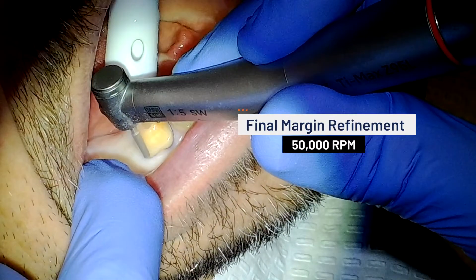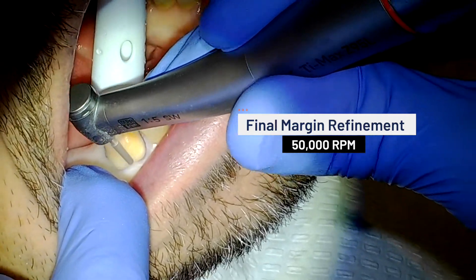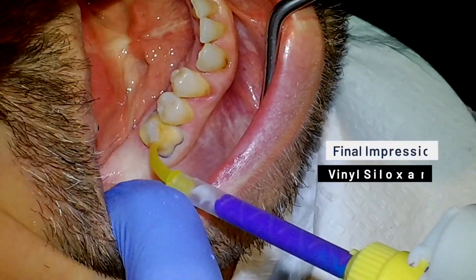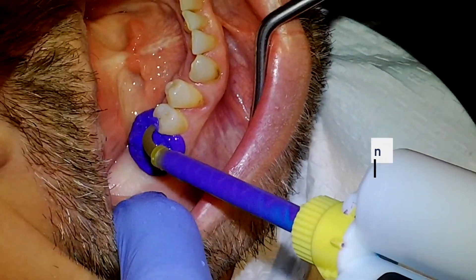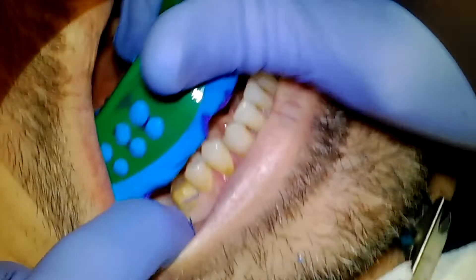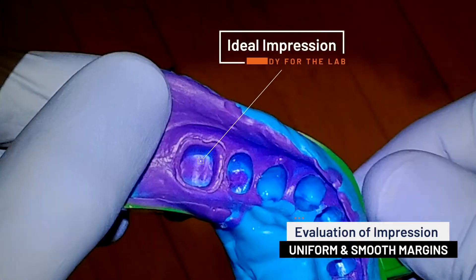With our NLZ electric micromotor set to 50,000 RPMs, we are ready to safely and effectively refine and smooth the tooth surfaces and margins. After careful inspection, our molar preparation is now ready for the final impression. For this particular case, we utilized a two-stage impression technique with an extremely accurate light body wash that would precisely capture the margin we created, followed by a heavy-bodied silicone in a stock tray. When we examine the impression, we are able to easily visualize a clean and accurate 360-degree margin.